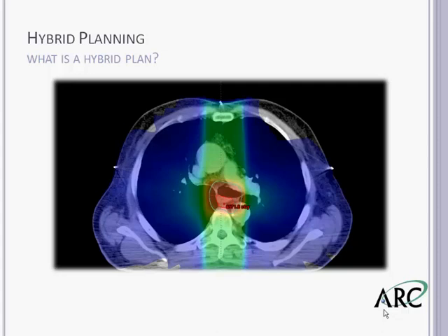If the physician wanted a more conformal plan, we might adjust weighting to give more from the VMAT. For centers who don't possess VMAT capabilities, step-and-shoot or sliding window IMRT can still be used to achieve an optimal plan.